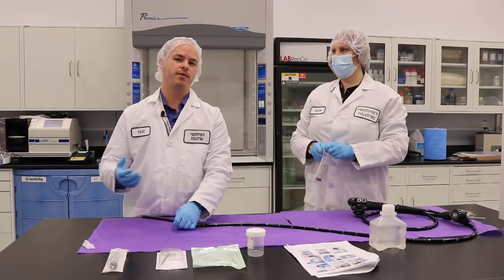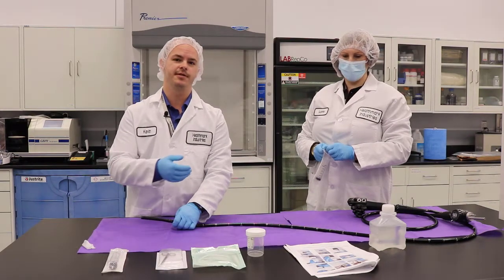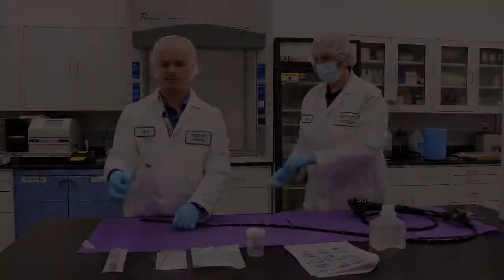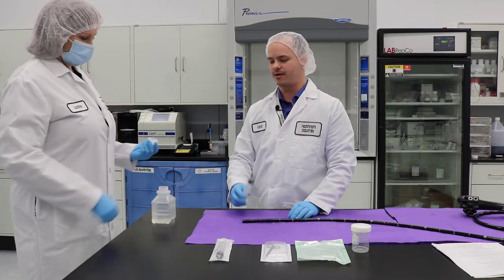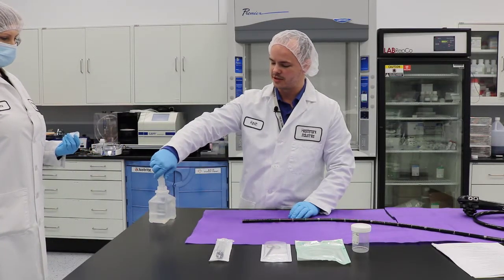In the next step, we're going to open up a 30 ml syringe onto our sterile field. Our facilitator is going to open up our sterile water and we're going to extract 20 ml of sterile water with our syringe.